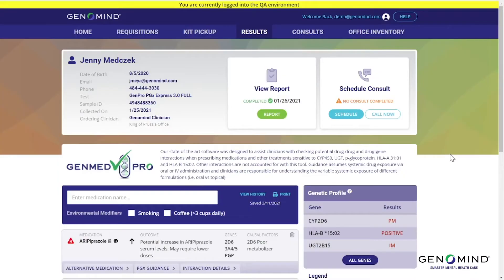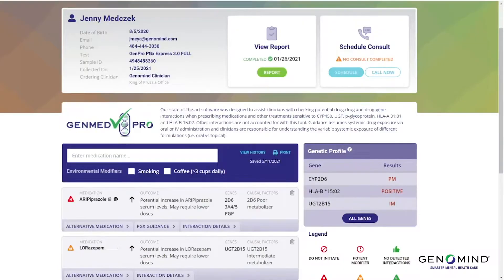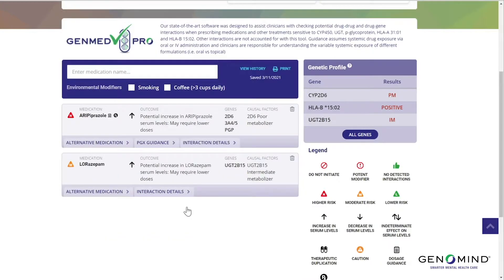Once you select your desired patient, their profile page will appear allowing you to download their report, schedule a consult, and of course access our new GenMedPro software. For our legacy users, this layout may feel a little different than before.